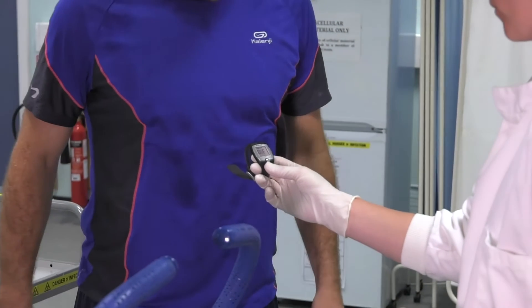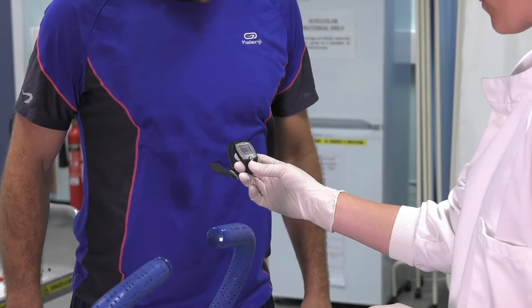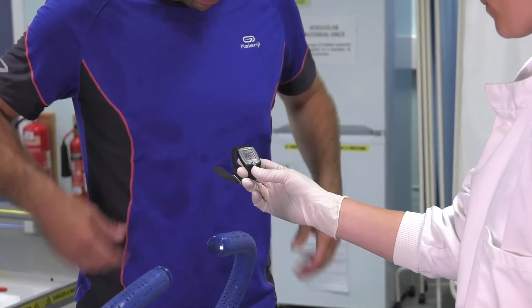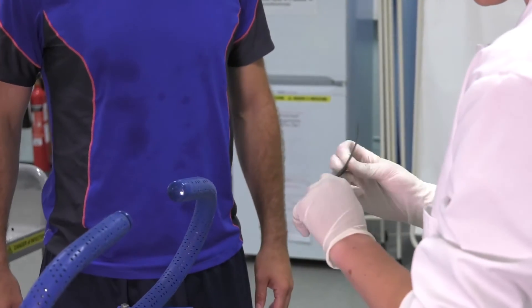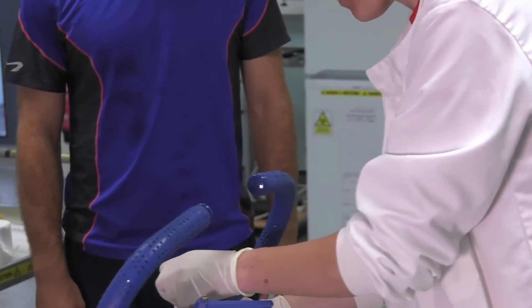Then check the heart rate monitor is picking up the heart rate. Once it's picked up, secure the heart rate monitor somewhere where the participant can't see it, but you can.